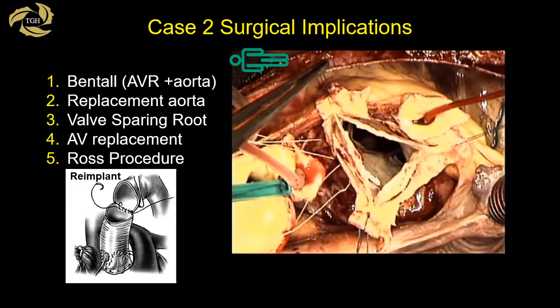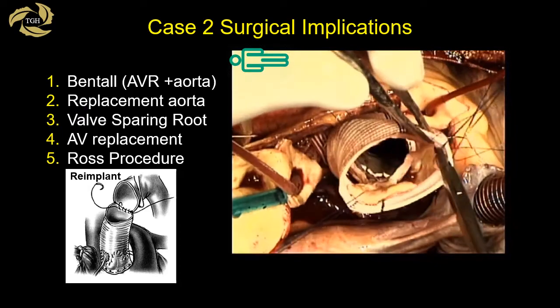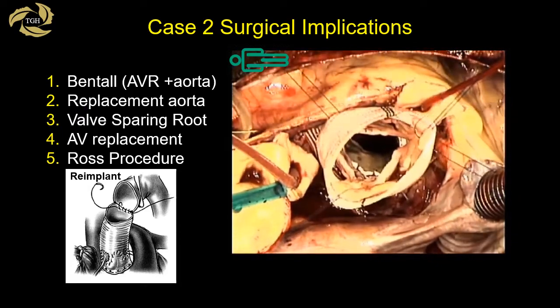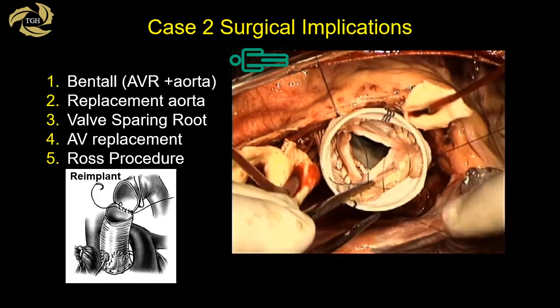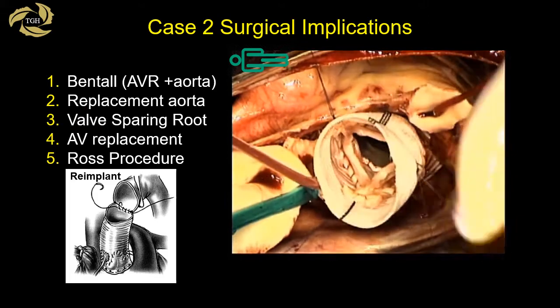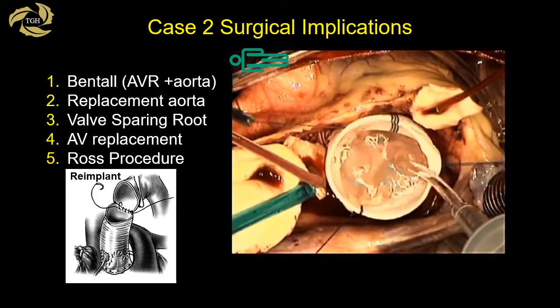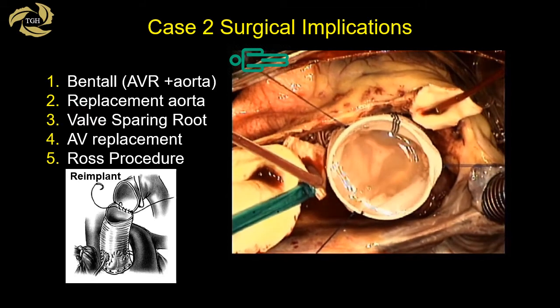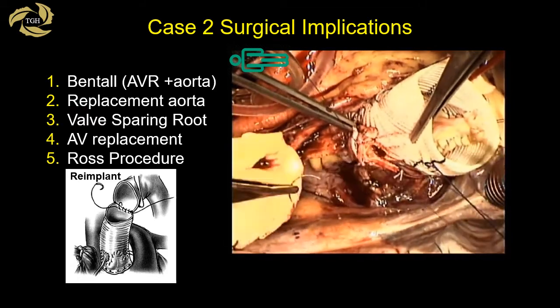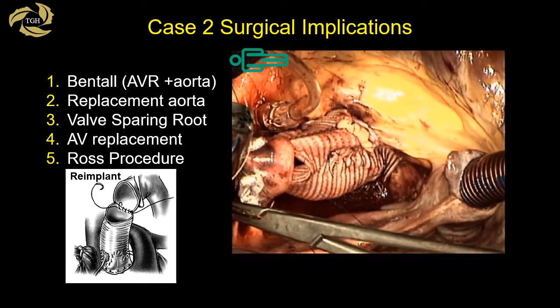This video shows the entire aortic wall is removed, only leaving the crown-shaped valve and commissures, which will be sutured inside the Dacron graft, as shown here. The water test is perfect, and the coronary arteries are reimplanted into the Dacron graft. The proximal portion is anastomosed.